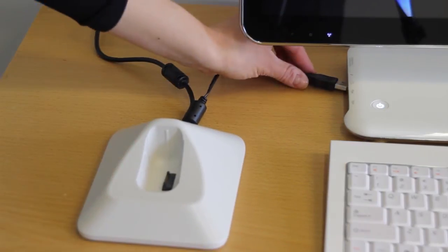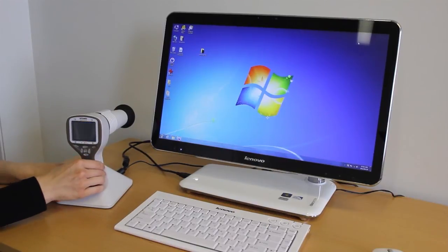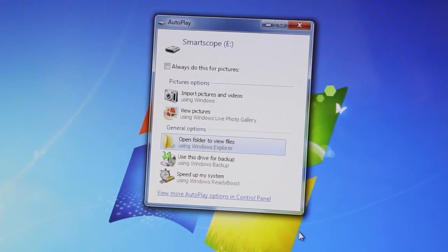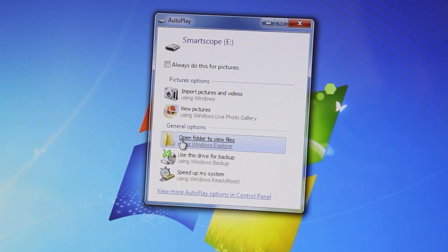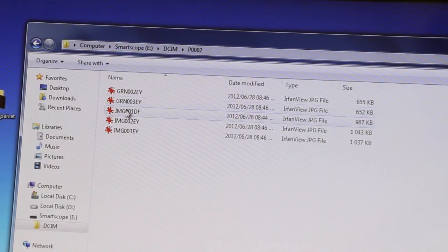Image transfer. After images are captured, place the device into the cradle. Image transfer works in a similar way as any other digital camera — the camera connects to the computer via USB and you can open the folder to view and store images on your computer.